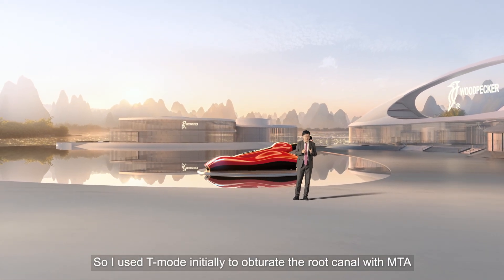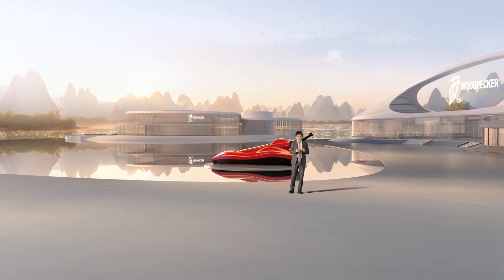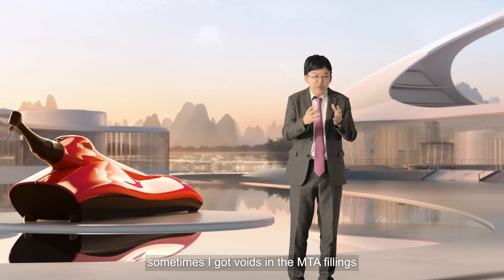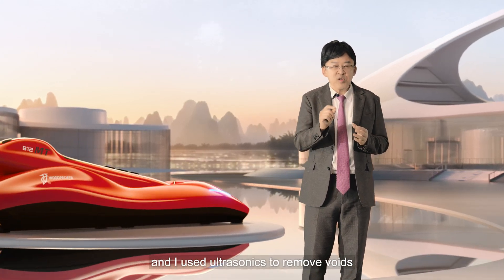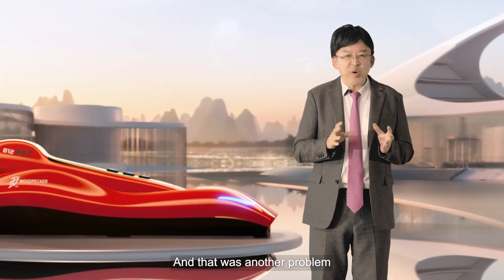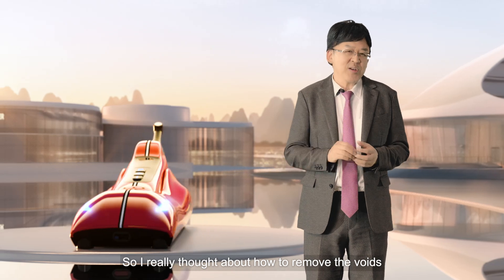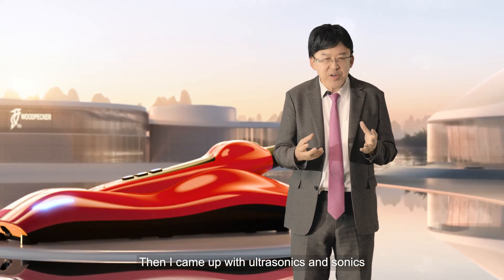I used T-mode initially to obturate the root canal with MTA. However, sometimes I got voids in the MTA fillings, and I used ultrasonics to remove them — which was another problem. So I really thought about how to remove the voids, and then I came up with combining ultrasonics and sonics.